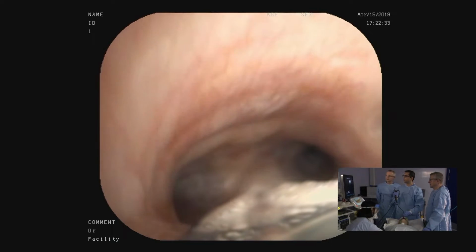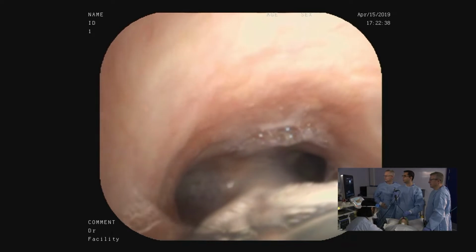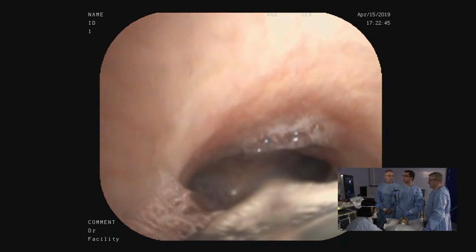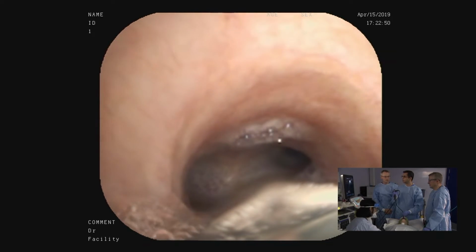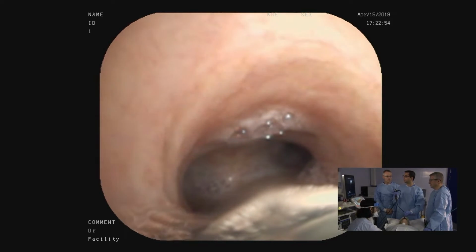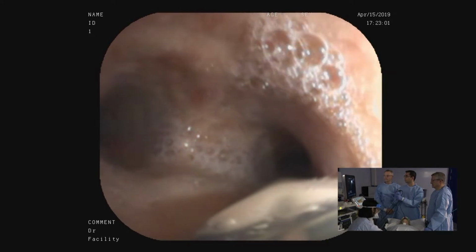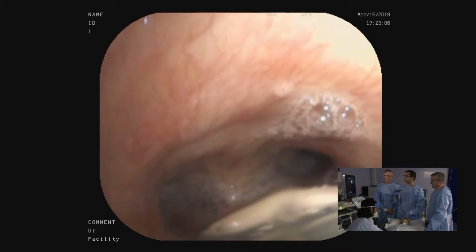I'm very quickly going to talk about the 6 landmarks which have been mentioned in the combined guidance from the European Society of Gastrointestinal Endoscopy, European Society of Thoracic Surgery, and European Respiratory Society. Now, I want to make it clear that this guidance is primarily for beginner operators, for trainees, because it does miss a number of stations which can be accessed and appropriately used for staging. So the first landmark point is station 4L.